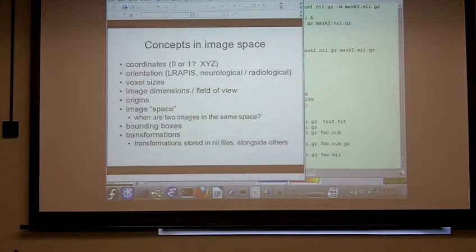Is it related to any coordinate system or something? Well, yeah, one of the big things that happened between MRIcro and MRIcron was NIfTI support. And MRIcron makes an effort to support NIfTI orientation information, which is stored in the header. MRIcro doesn't. So MRIcro basically does the same thing that the VoxBo viewer does, which is it gives you the x-axis from left to right, the y-axis this way, and the z-axis in slices.